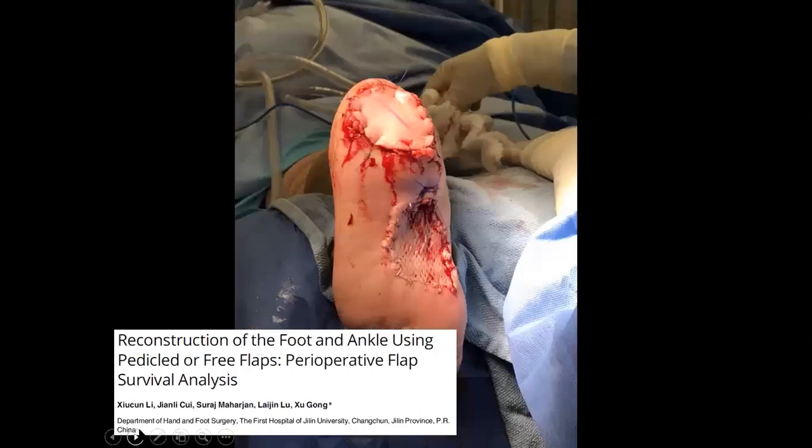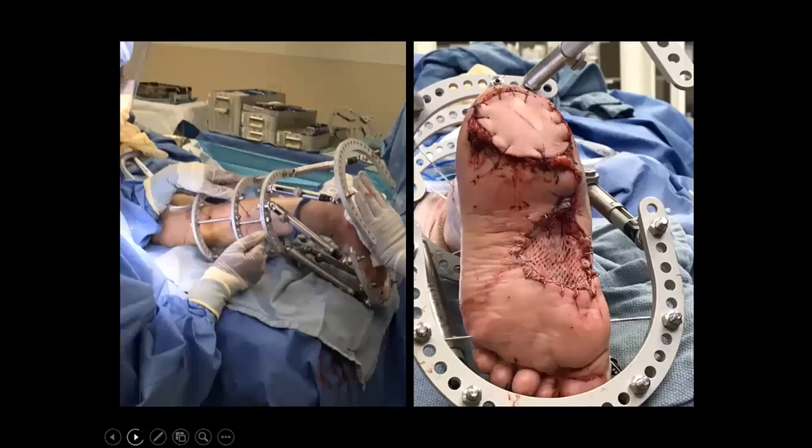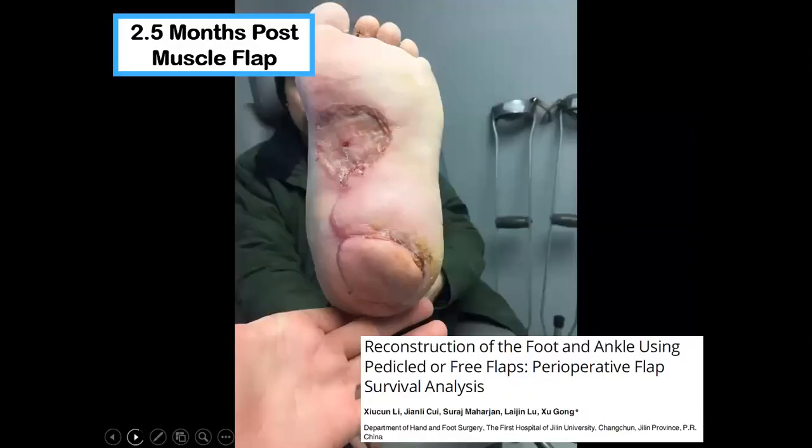There's my transposition of the flap to the plantar heel. You can see on the edges there's a little bit of bluing or venous congestion, so I ended up popping a couple of those sutures and stabilizing it with an external fixator, not only for motion prevention, but also to protect that heel. Any pressure on that heel is going to be detrimental to the flap and will end up necrosing it. So unless you're making the patient lay on their belly for the next few weeks, you're obviously going to need to offload that area.